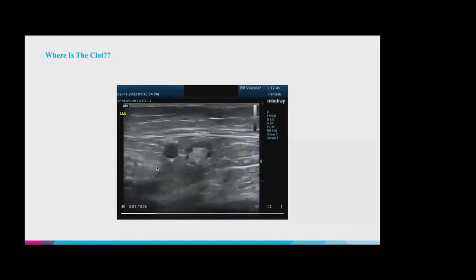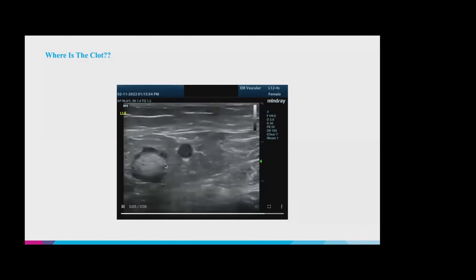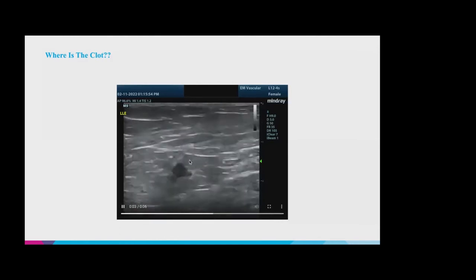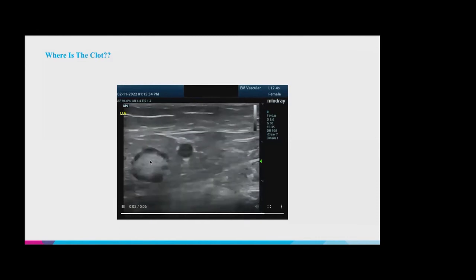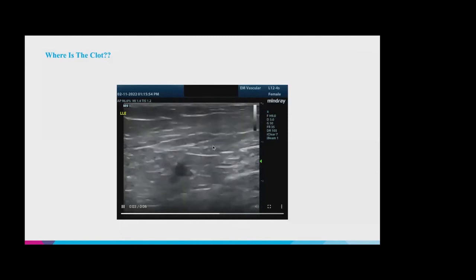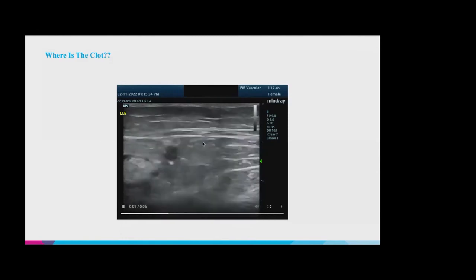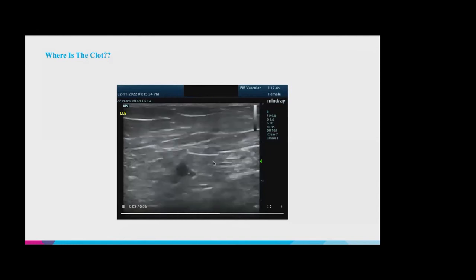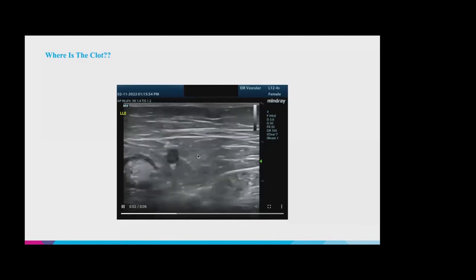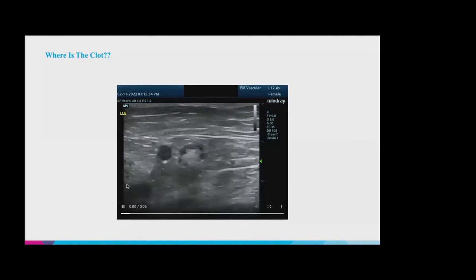But these right here are actually examples of lymph nodes, and you can tell they're lymph nodes as opposed to veins because you see how the walls are kind of irregular, and the clot mimicker that's in the center is really very bright, taking up like 90% of the structure. And as we're fanning in and out, you can see the diameter of the structure disappears and expands and disappears. So this is something that's only a couple centimeters long. So these are examples of 2 lymph nodes actually.